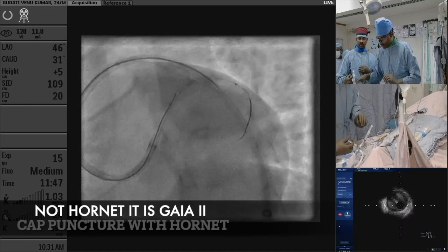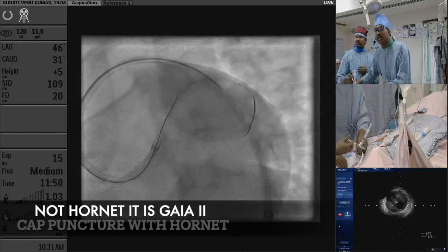So it's in the direction, right? But I'll just check.